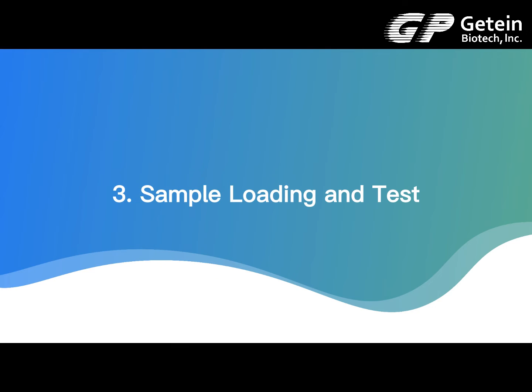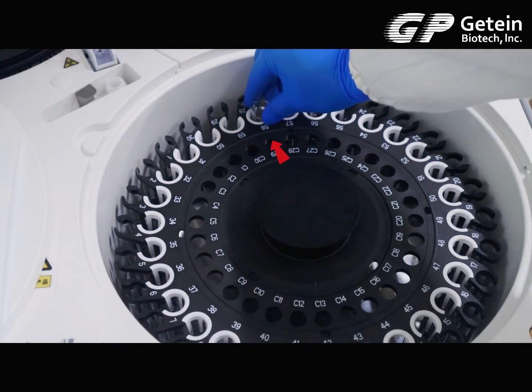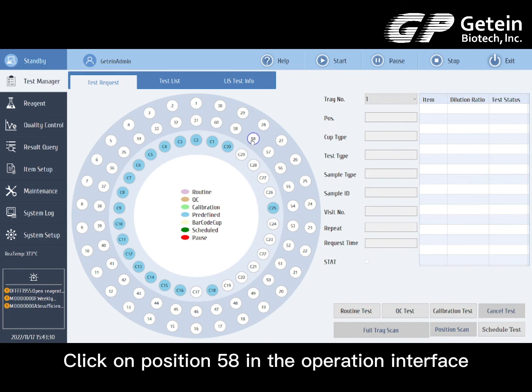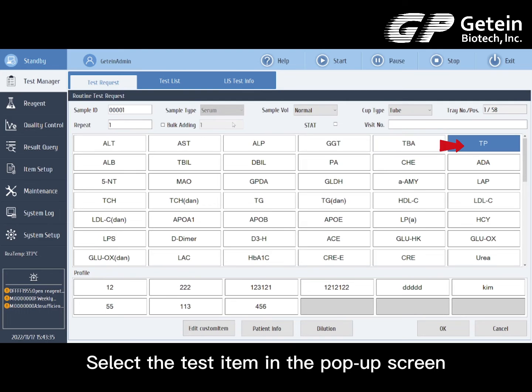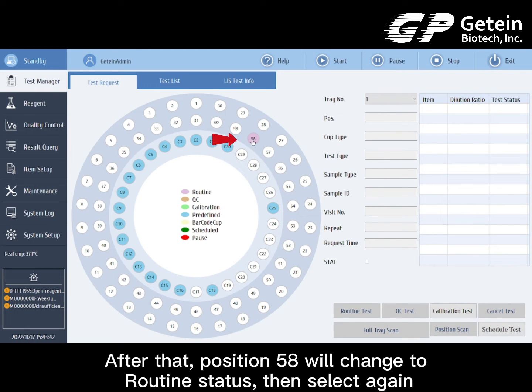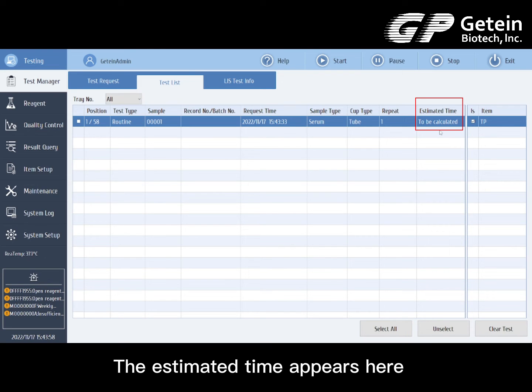Sample loading and test. Open the sample tray cover and insert the sample, then close the cover. Click on position 58 in the operation interface — the different stages of the experiment show different colors. Click the routine test button, select the test item in the pop-up screen, and select the number of replicates of the sample test. After that, position 58 will change to routine status. Click on schedule test to start the test. The estimated time appears here.